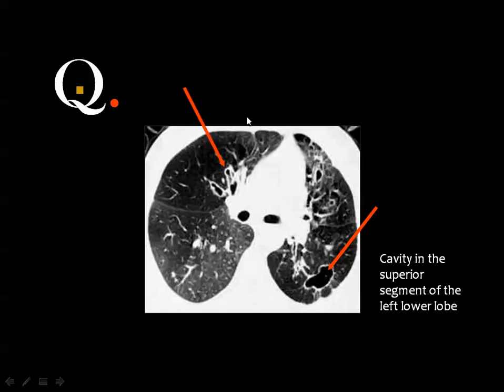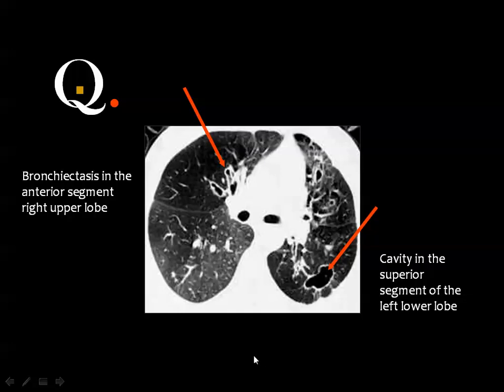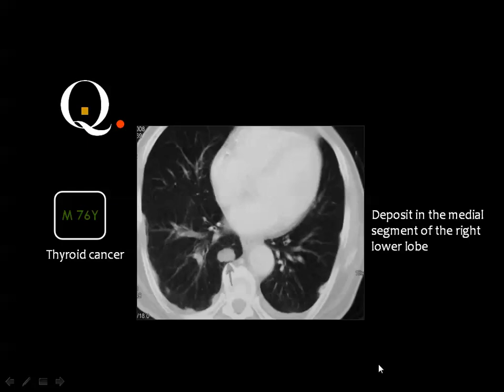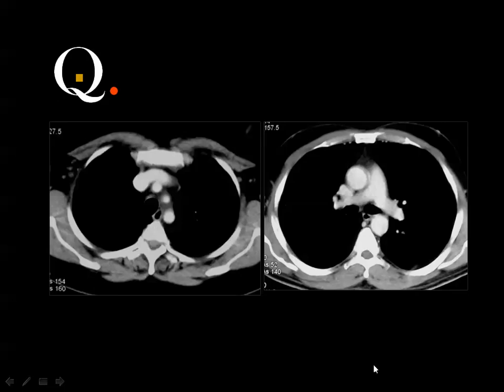A thyroid carcinoma patient has a metastatic deposit in the medial segment of the right lower lobe.